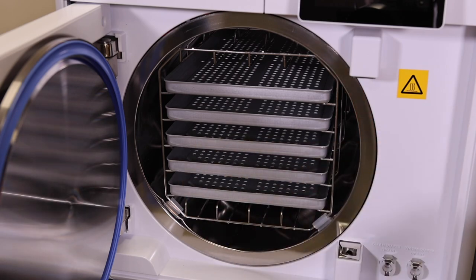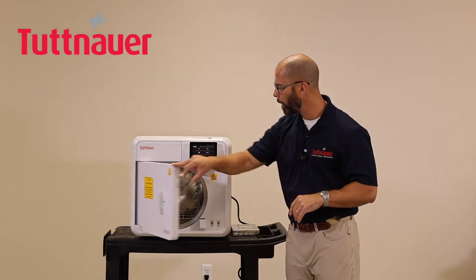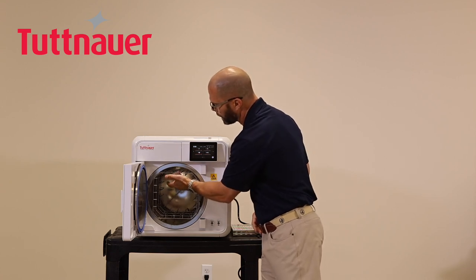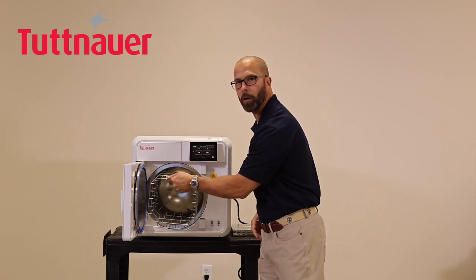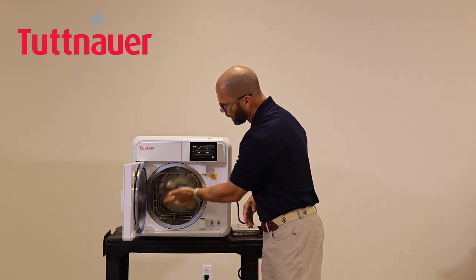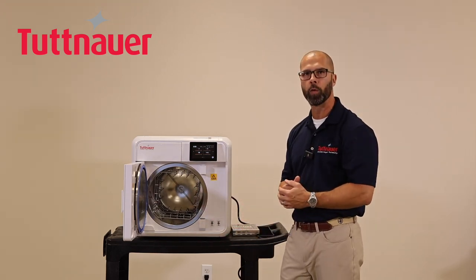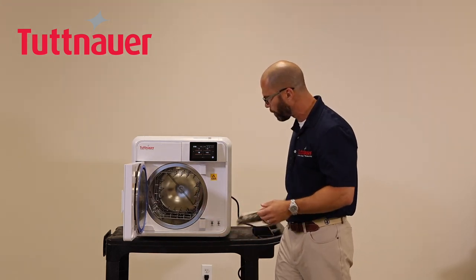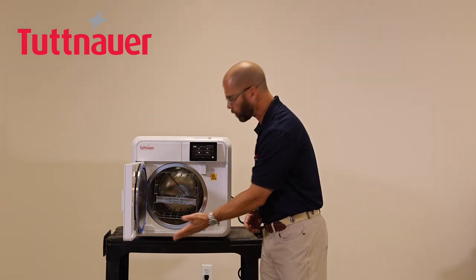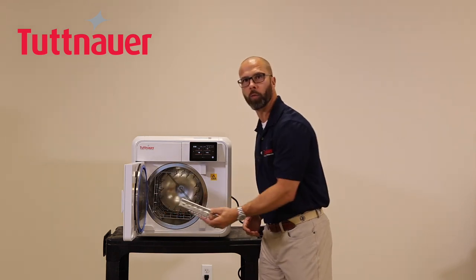If you're using cassettes, the unit comes with a tray holder that slides easily in or out and can also be rotated based on cassette size. For example, a cassette can be inserted sideways or lengthwise depending on its dimensions, giving you flexibility in how you load instruments.